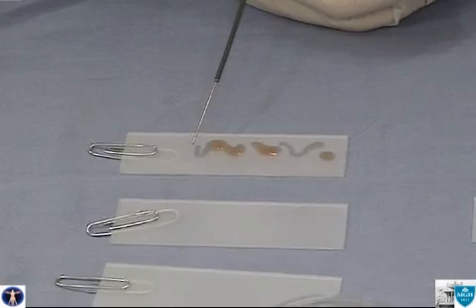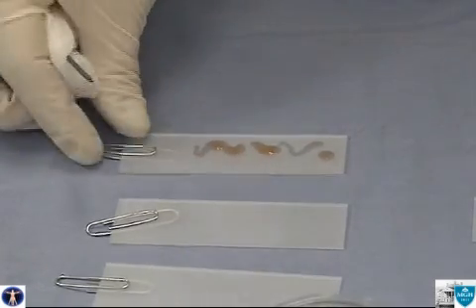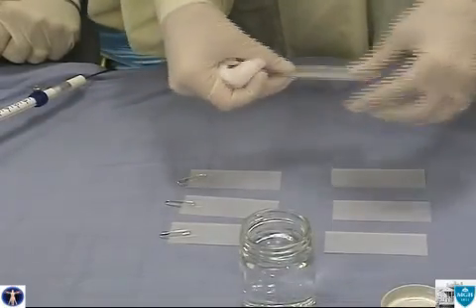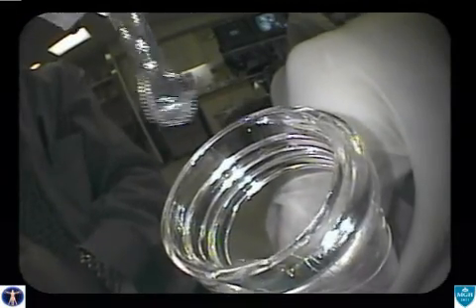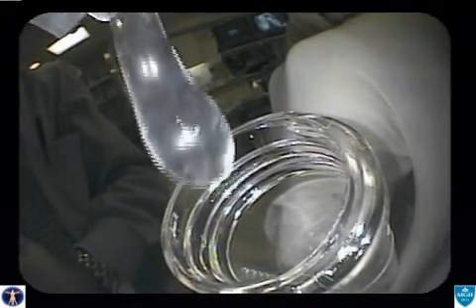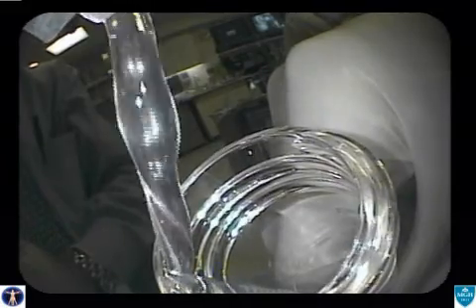Small samples of fluid are placed across the glass slide, and then a second glass slide is used to make a small, thin smear that is used for cytologic examination and stored in ethanol. Excess fluid is also used to be analyzed for chemistry such as CEA and amylase.